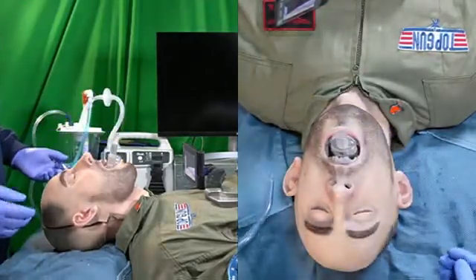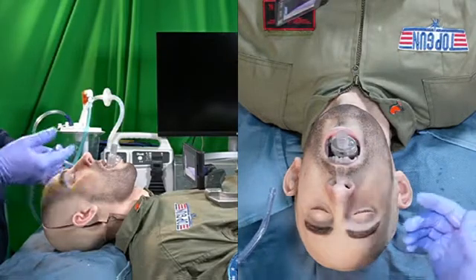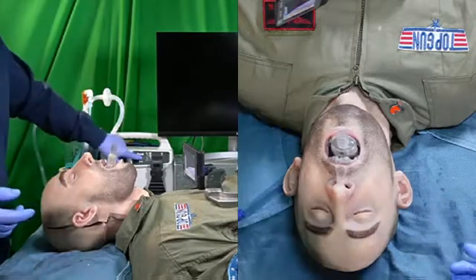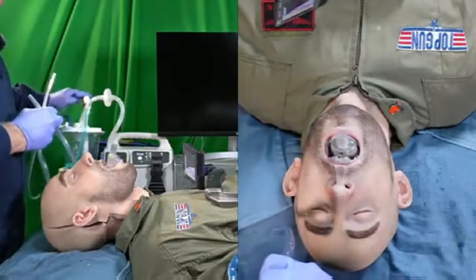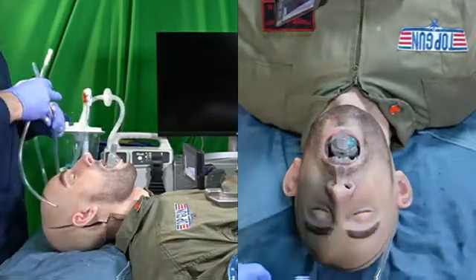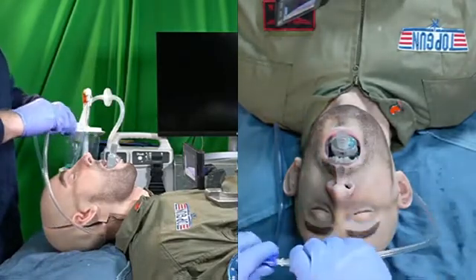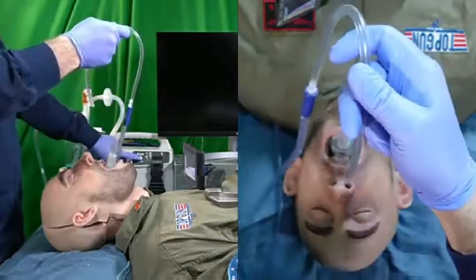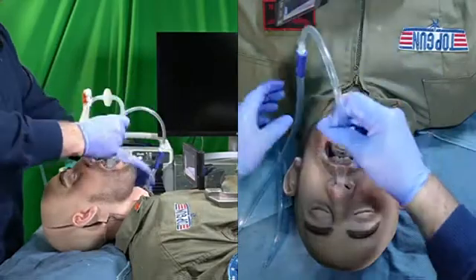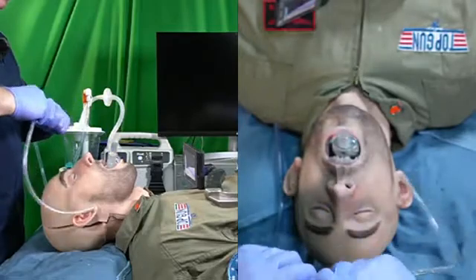Before I ventilate the patient, I'd like to suction this airway to ensure that I don't have a contamination of the ventilation channel. There's two ways to achieve that. I'm going to recontaminate the iGel just to make a point here. We can see some airway contaminant coming out of the drainage channel. I'm going to be using a flexible suction catheter down the supraglottic airway now. And now we're ready for ventilation.